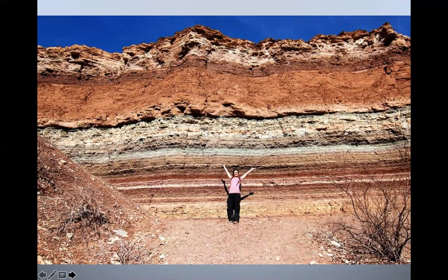If we're flying over this canyon, looking down, we're looking at the topographic, TOP, landscape. When we're down in it looking at the slices, we're looking at the tomographic, TOM, slices of the hillside, but it really reflects what it looks like when we look at retinal tissue as well.